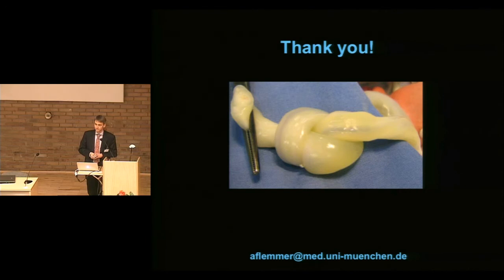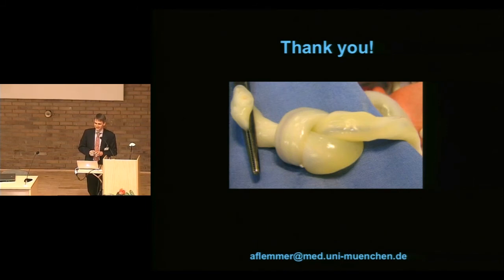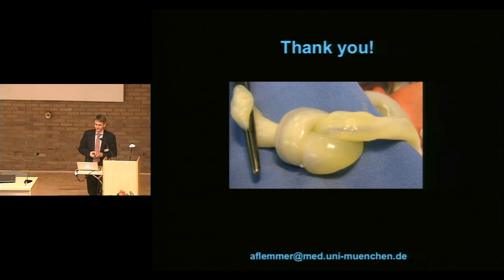When talking about umbilical venous catheters, everybody always says, and then you place it. And I think most of us will agree that the really difficult thing is not to get it stuck in the liver. Most of us will know a trick that we're really happy that when it occasionally works, pressing on the liver can make you come through the liver, can open up the ductus venosus. Are you or anyone else aware of techniques that can increase the success of umbilical venous catheter placement?